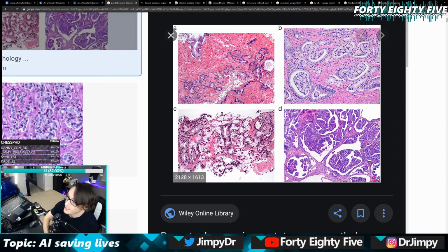So histology is the study of tissues and tissue structure, and effectively it's image based, and histologists generate very pretty pictures like the ones we can see on the screen right now, right? What's actually happening is that a sample of tissue, a sample of your body, is taken in a biopsy, punched out with a needle or a syringe or something, and then it's cut very, very thinly, almost one cell thick, and then it's stuck to a glass slide, and then it's stained with certain chemicals that reveal its structure and shape, and that's what we can see here.